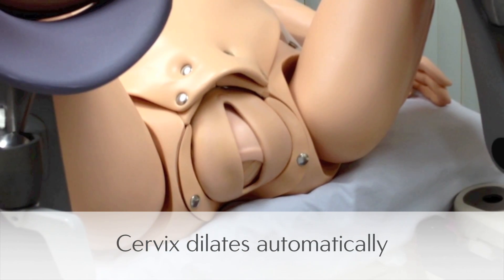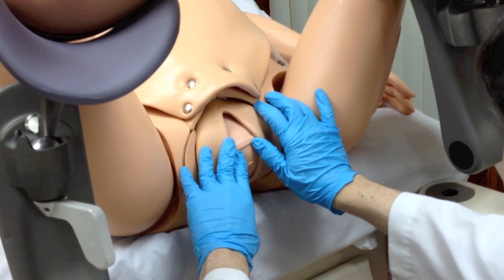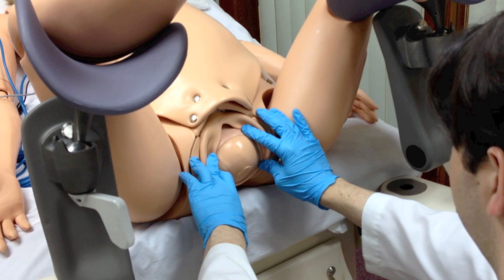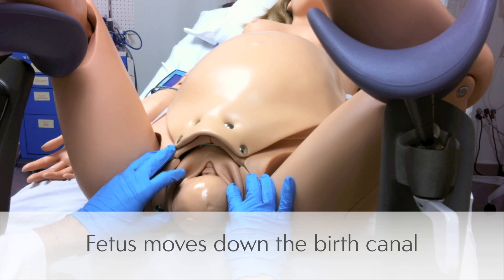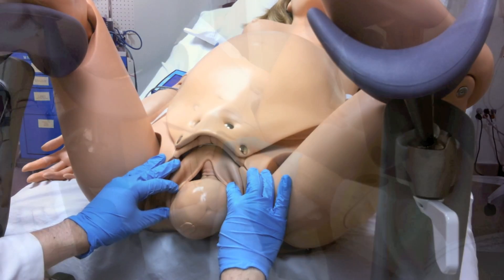NOEL's cervix dilates automatically as the fetus moves down the birth canal, starting out at one and a half to two centimeters and dilating as the baby progresses. During delivery, the fetus begins in ROA position and rotates while moving down.